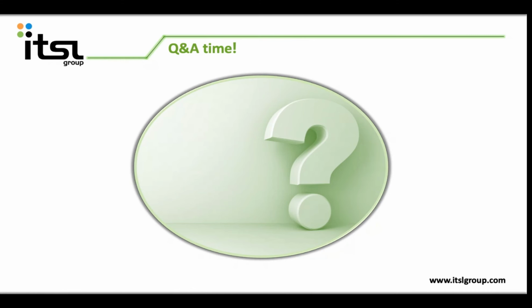We have another one. Is it best practice to record video for future reference, and do these solutions have that capability? Well, one of them does at this stage, so I'll answer it in two parts. The tablet does not have the ability to record video. The mid-range camera, we can attach a network video recorder to that, but it's not an integrated system as the professional one is.